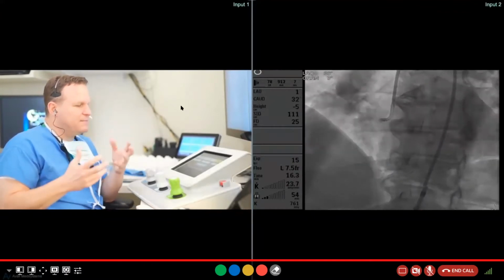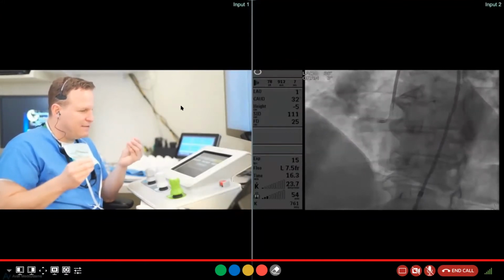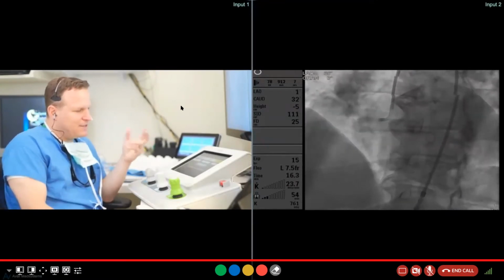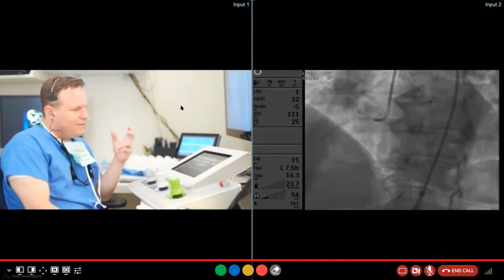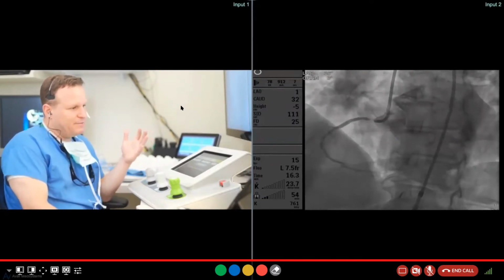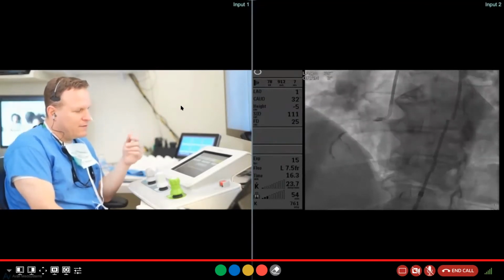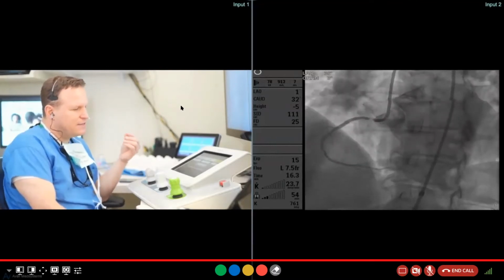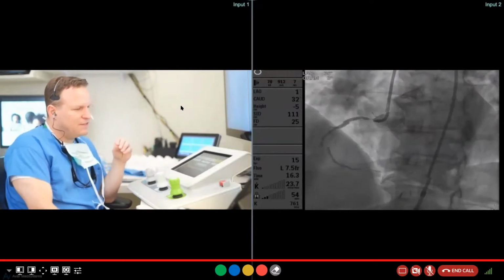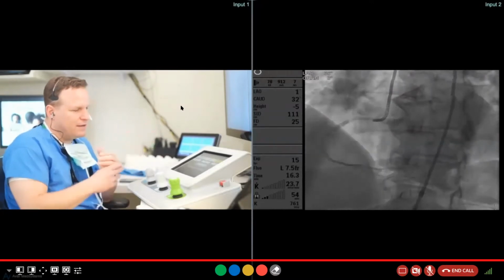A couple of things we learned out of the gate is that, one, you don't currently have the tactile feel, which most of us, yourself included, like. But while it lacks that, there's excellent precision, and more importantly, we also found there's unbelievable radiation mitigation. And so we're finding more and more uses. I've done Impella cases with robotics. With cases such as CTOs where I still need a lot of tactile feel, I don't typically use something like this. I would make the connection, balloon it up, and then from there switch over to finishing it with the robot. And I'll show you.